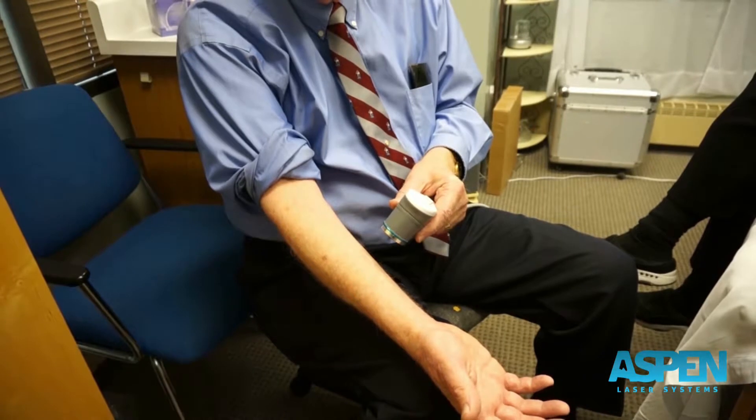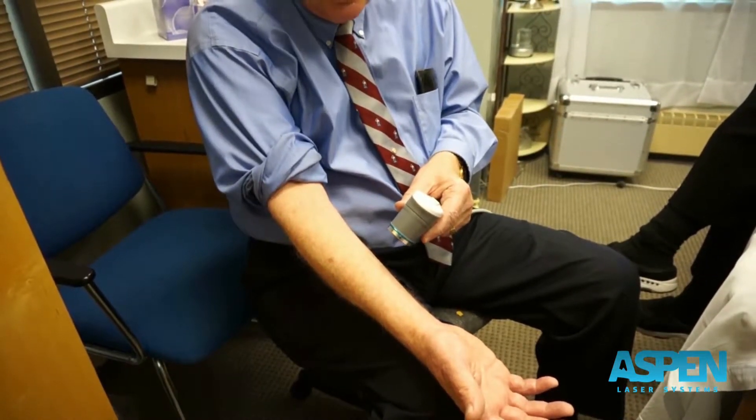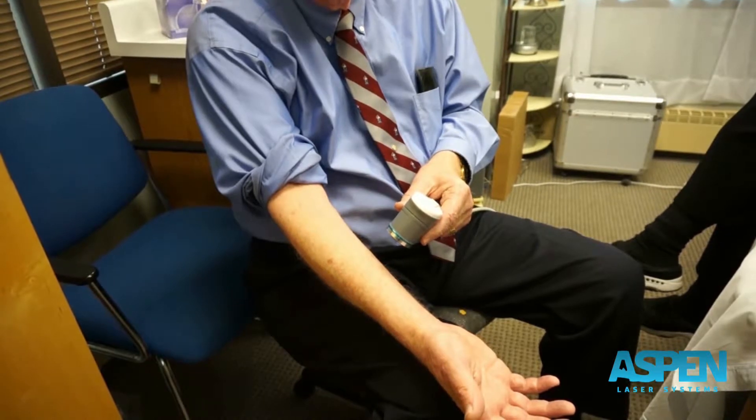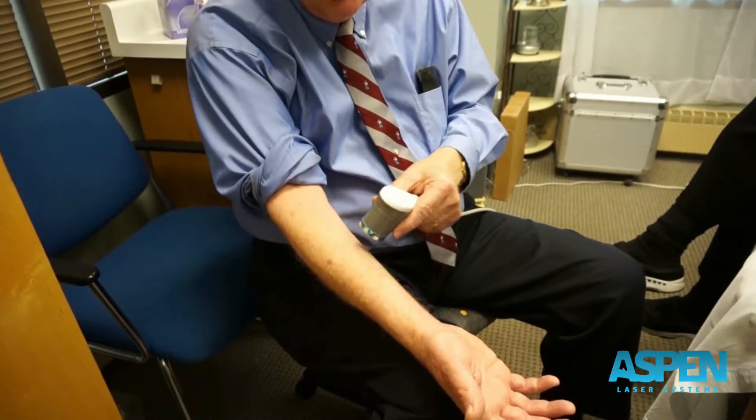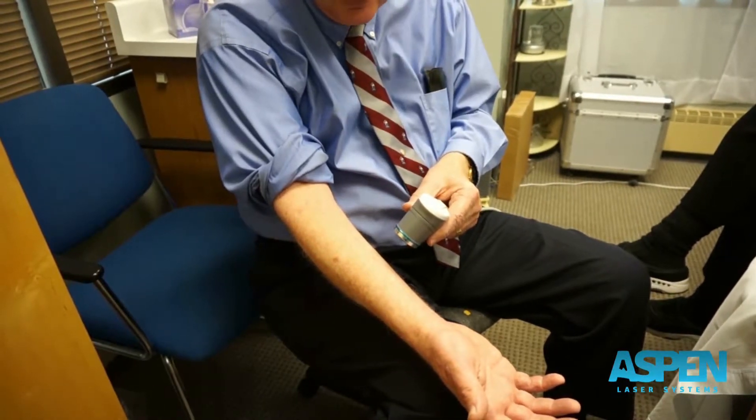With three or four inches, you've lost at least a third to a half of your near-infrared. So if you're doing 10 watts, all of a sudden you're down to about five. This waving it around in the air is not doing anybody any good — you're losing half your dose.